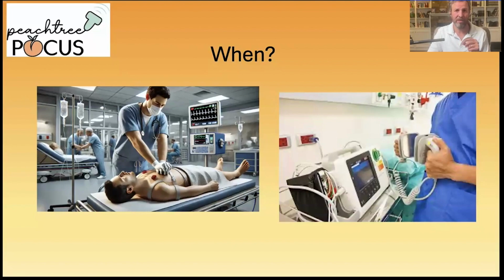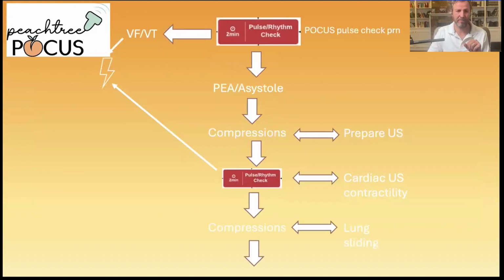What I'm going to show you on the next slide is an algorithm for integrating POCUS into cardiac arrest management. This algorithm is not from the ACLS guidelines, and it's not published anywhere. This is my own personal algorithm, the way I integrate POCUS step by step when I'm running a cardiac arrest. This comes from years of experience combined with the core understanding of what POCUS can do, while also keeping top of mind that defibrillation and continued compressions are key while searching for reversible causes.